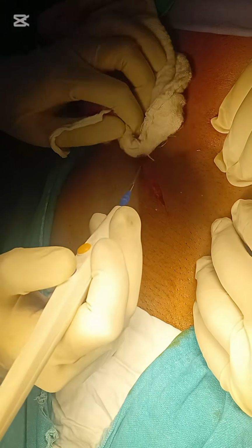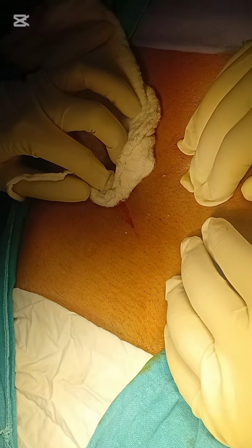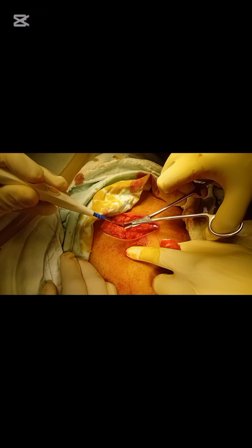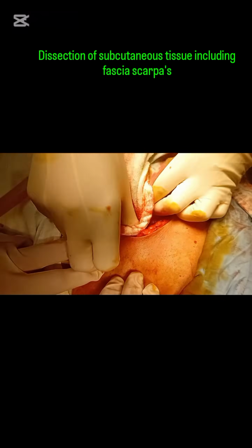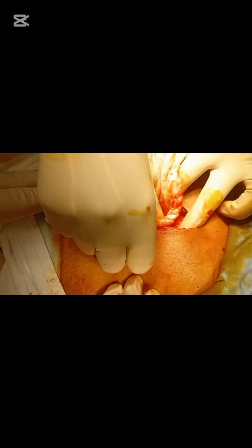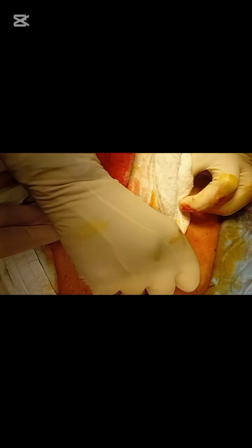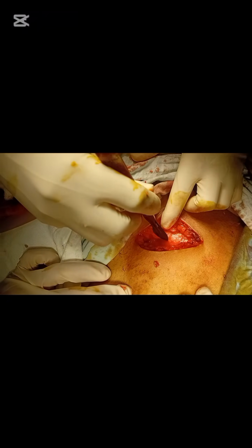Secure hemostasis, otherwise it will obscure your field and make you operate imperfectly. Now take a scissor and separate the subcutaneous tissue. We will face Camper's fascia. It is an extension of subcutaneous tissue, and then Scarpa's fascia. It is also considered as the deep fascia.